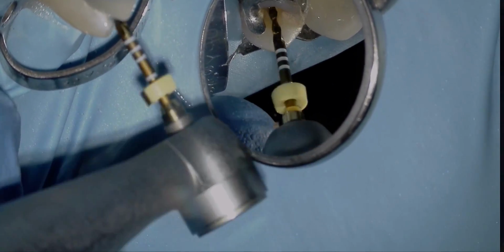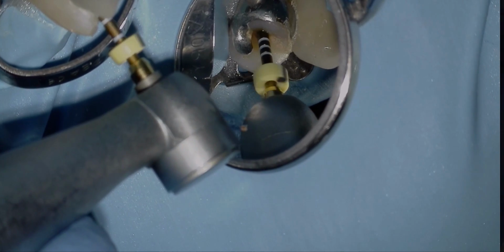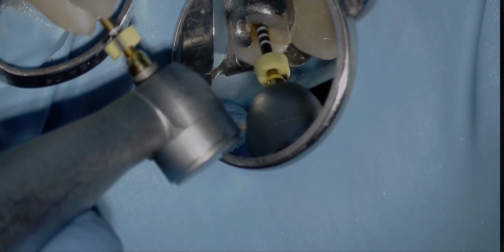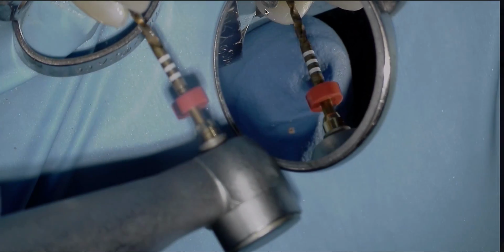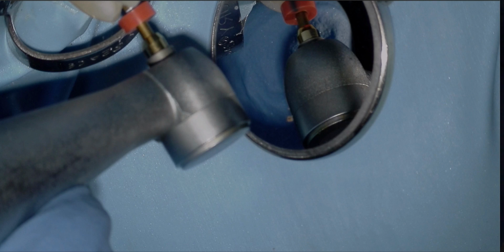So what I'm going to do here is, because I do have a basic glide path, it's not huge. I kind of shortcutted my glide path a little bit. But what I'm using here, so this is my palatal canal. So let me go back there just a little bit. I've opened up my glide path with a number 10 file.